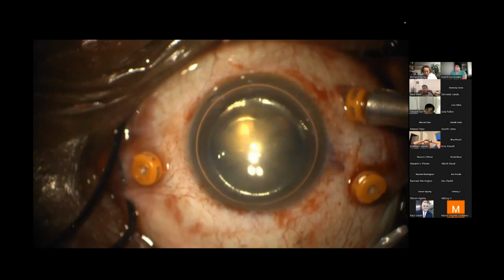By the way, a small remark: when you do phakic patients, we always need to do an IOL Master before, just in case. But this is my point: would you deal with the lens if you think the lens is not going to stay and the silicone oil will come forward?